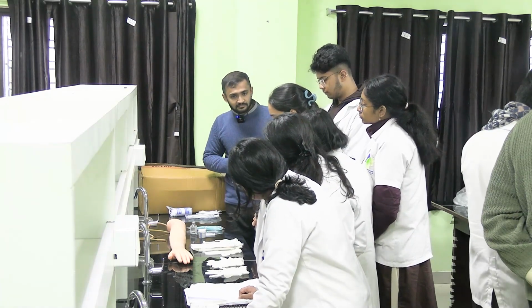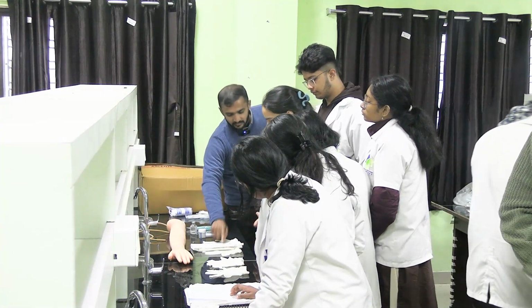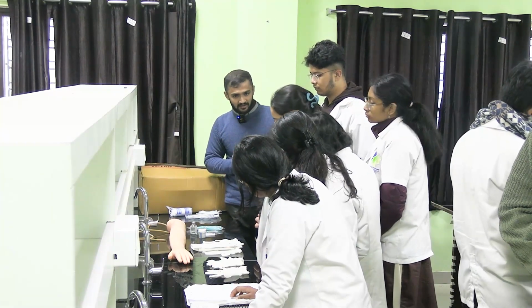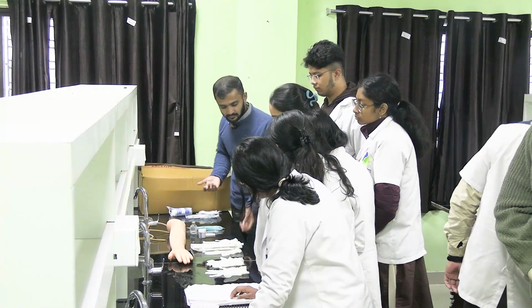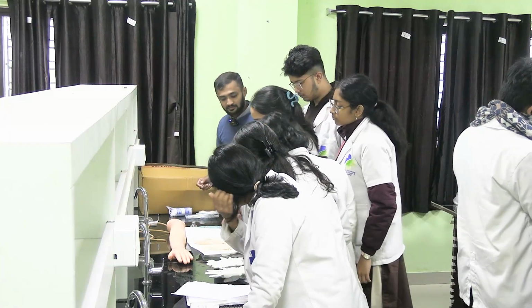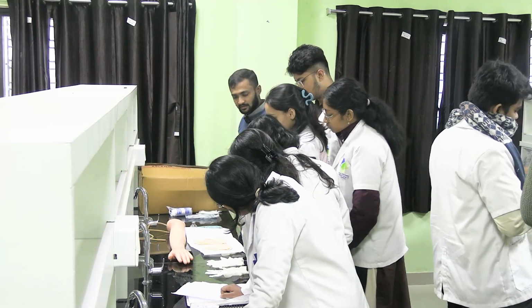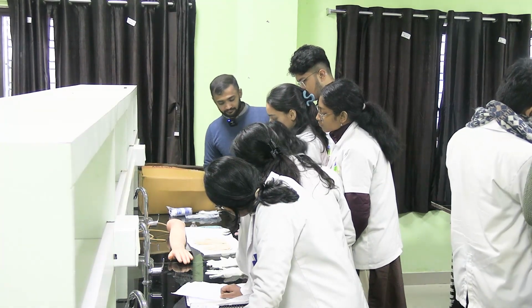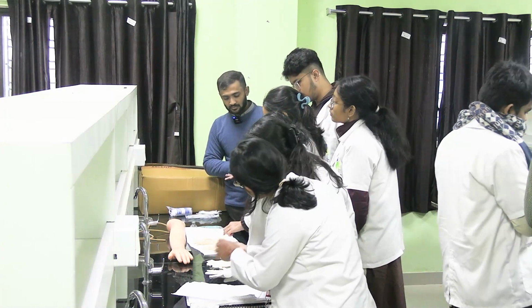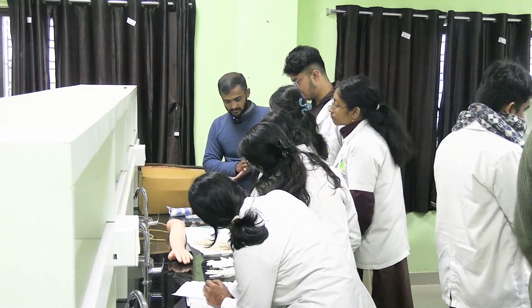Second, after opening the seal, you have to check the size. Sometimes it might be too tight or too loose. It should properly fit your hand. Then comes which side, either right or left. How will you understand whether it is right or left? By the thumb, anatomical position. If right, it should be towards your right. If left, towards your left. Then how will you wear? Which is the sterile part in the gloves? The outer side is the sterile part.